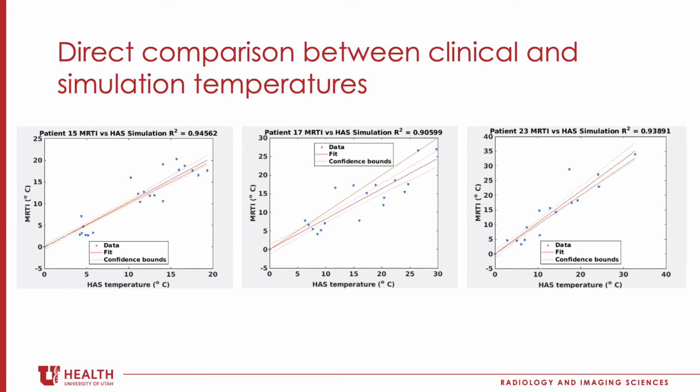The plots shown here each contain the last few sonications from the same 3 different patients as the previous plots. They compare the temperature of the clinical phase simulation to the MRTI temperature at the same time points. The time points are from the first 3 of each sonication. The plots show how well the temperatures are matching during the beginning of a treatment as temperature rises.